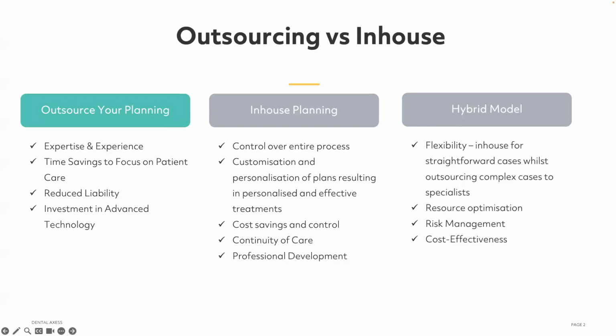Before I hand over to Dr. Tania, I will be discussing two primary approaches to treatment planning for clear aligners: outsourcing versus in-house planning. Now, each method has its own benefits and considerations, and finding the right balance between them can optimize patient care and practice efficiency. Now, let's begin with outsourcing.